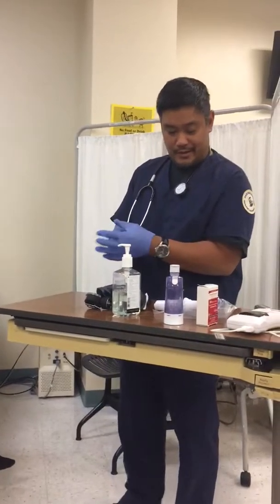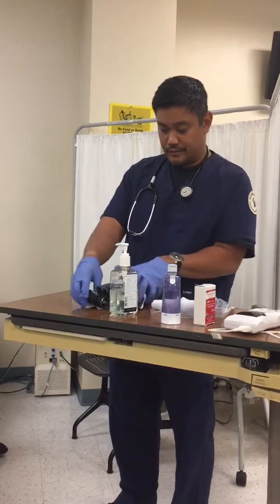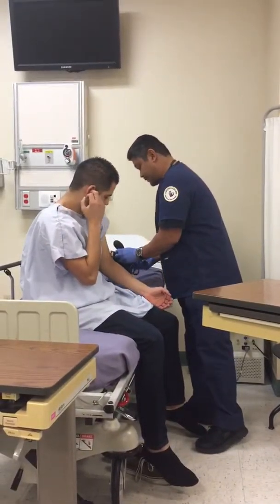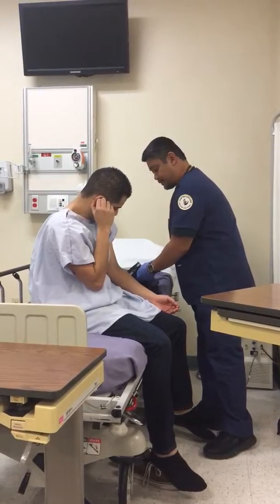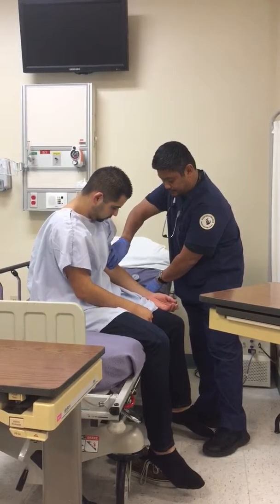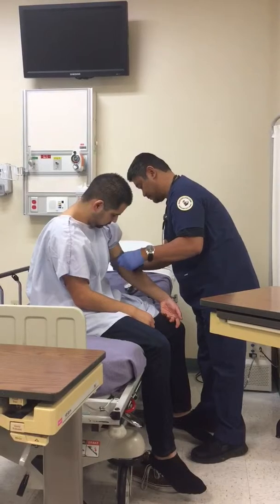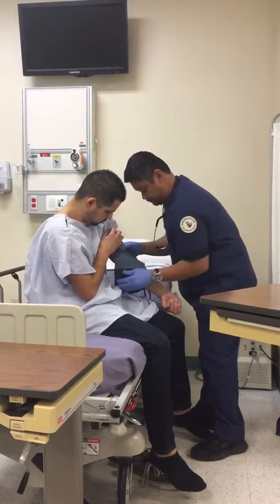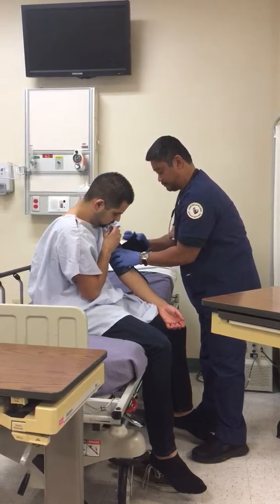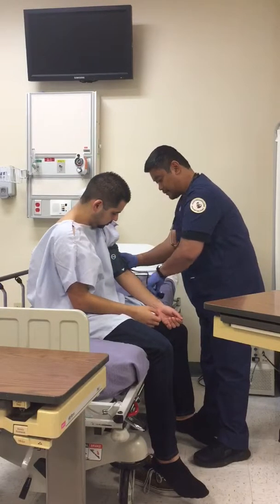All right, Christian. So we'd like to start with taking your blood pressure. May I use this arm? Sure. So let me know if it's uncomfortable, okay? Okay. Would you mind holding on to this for me? Yeah, sure.